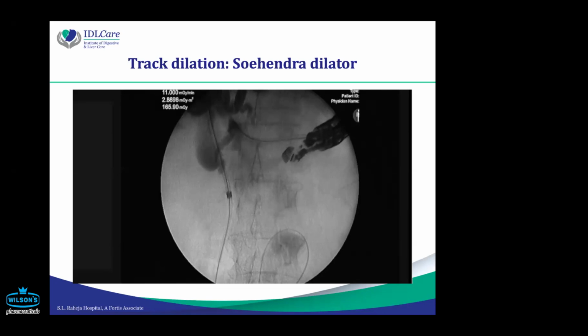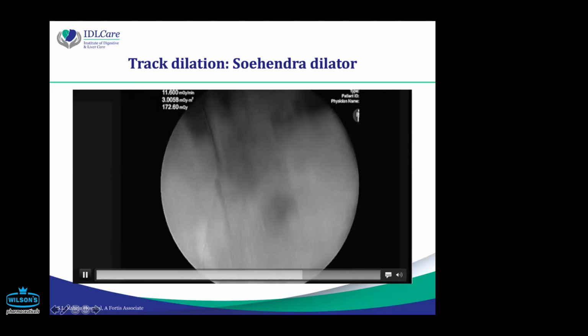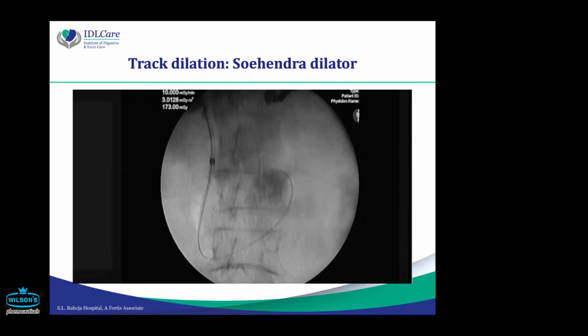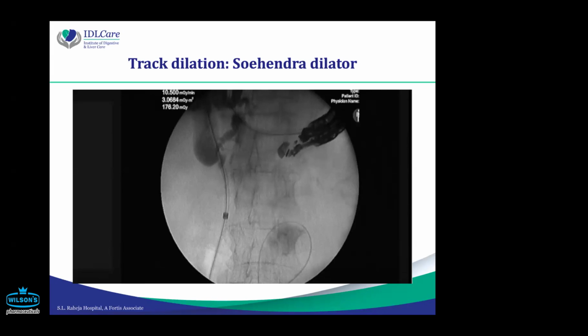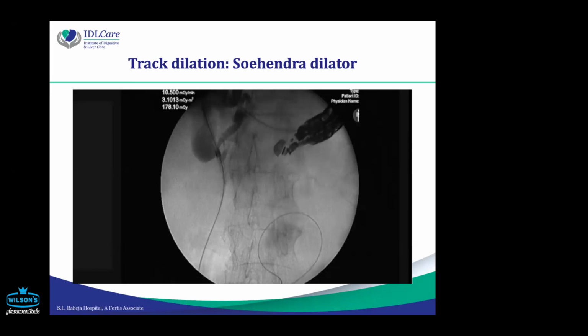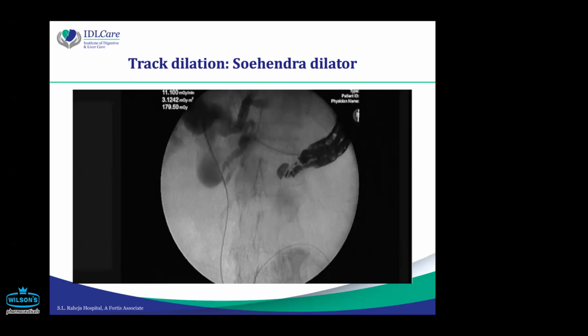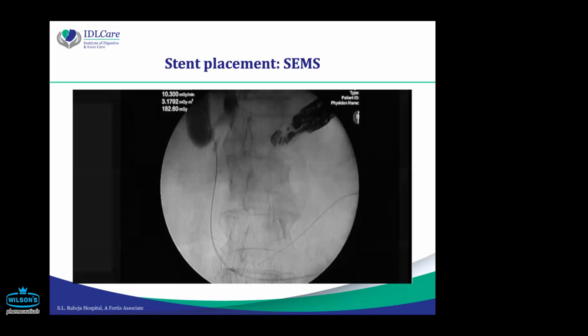So yes, this technique, if you compare it to choledochoduodenostomy or hepaticogastrostomy, probably takes more time. And you will not see many publications about antegrade procedure because it's a bit cumbersome. But I don't know, I love the procedure and I find transpapillary drainage, probably I'm an old timer, I like it. I first try to do a transpapillary drainage either via a rendezvous or via an antegrade drainage.